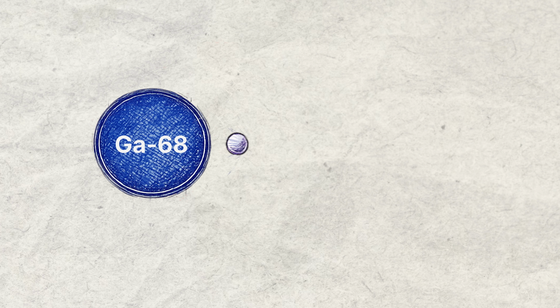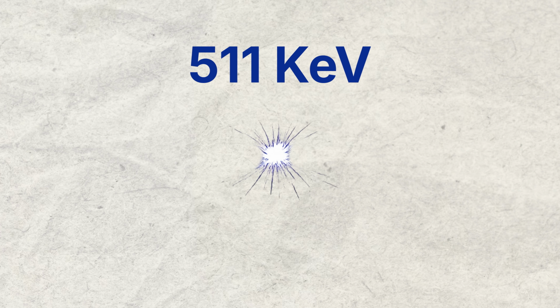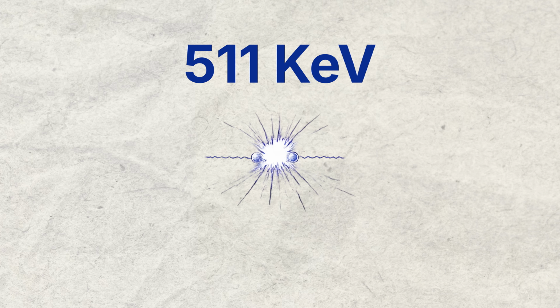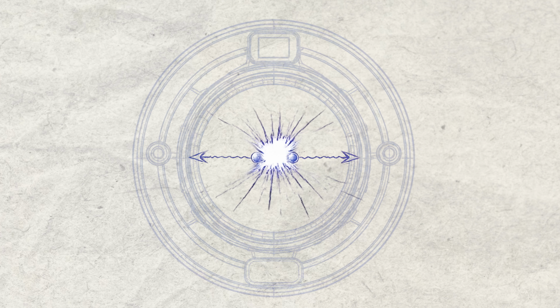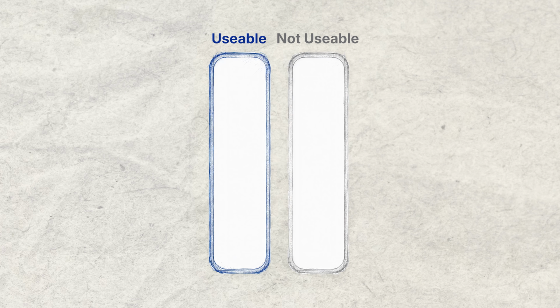When a radioisotope is unstable, it gives off a positron, and that energy leaves the isotope and travels a short distance and hits an electron. When an electron is annihilated, it shoots off 2 511 keV photons in exact opposite directions. That's the magical number detected by a PET system. As those events are happening in a body, those are detected in different places, and an image is reconstructed from those data points. When you look at radioisotopes, they're decaying.